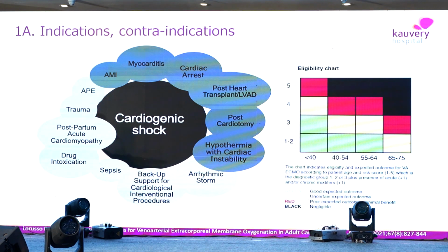So in the larger context, there are patients with primary cardiac issues who will benefit. Now the choice of who to take up for VA ECMO is something that will improve with experience. There are certainly guidelines available for you to go through. For example, there is a score, the SAVE score, which is published based on a retrospective cohort study, which can give you a number. Say, if the numbers are positive, then the survival out of this procedure is more than 75%. If we have negative scores going into the ECMO initiation, then the survival is 20% or lower.